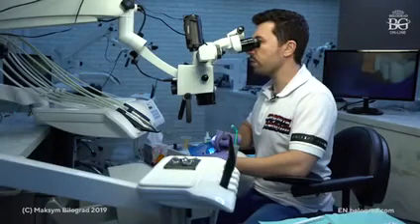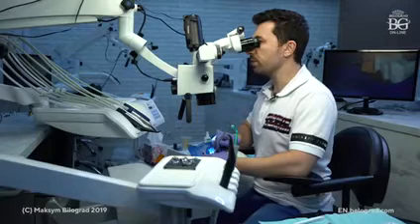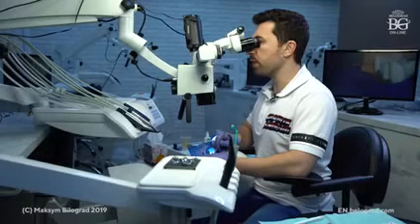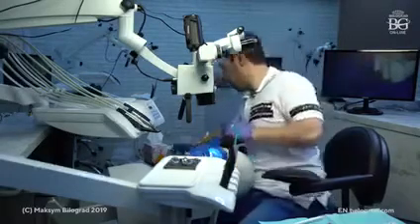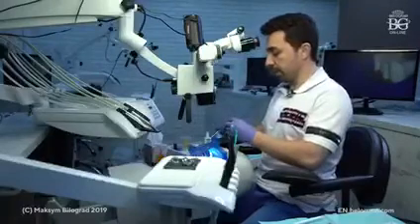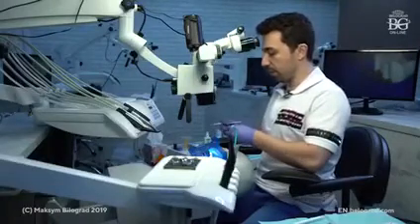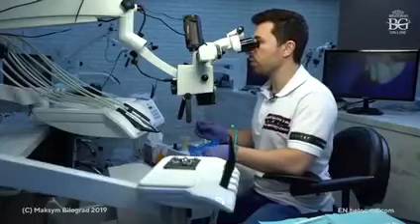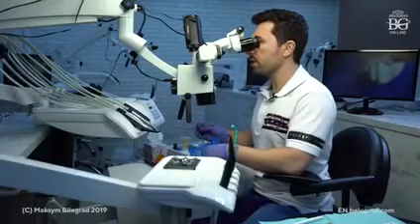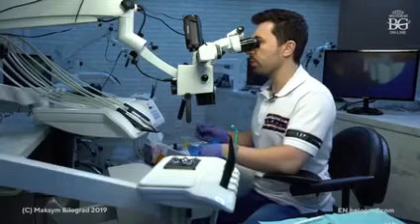You have to take the periodontal probe that is 0.5. I think it's halfway, right? 0.5. So basically, we prepped 0.4, 0.5. It's enough. Let me take the depth cutting burr silicone index for another tooth, which is the upper premolar, the first upper premolar.